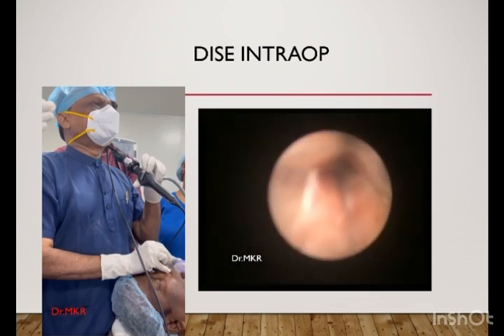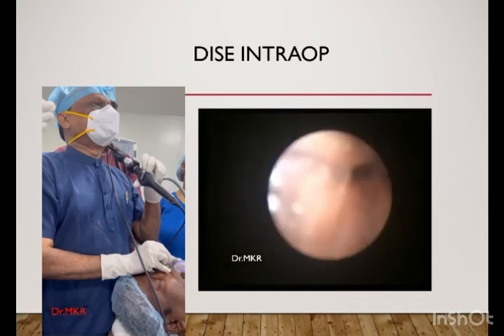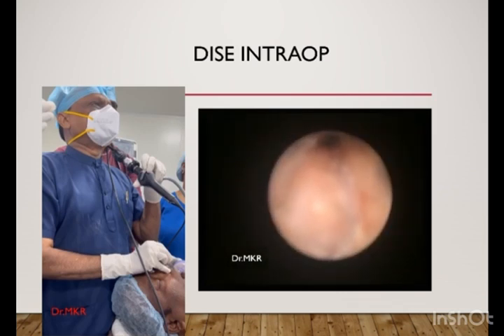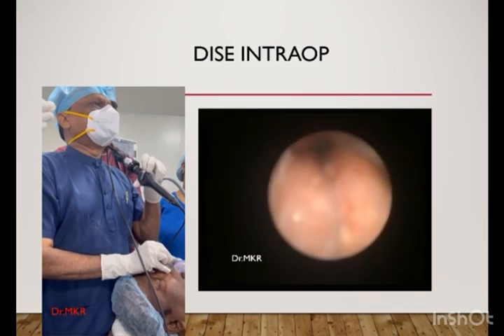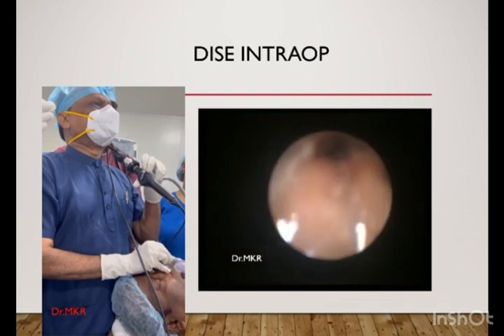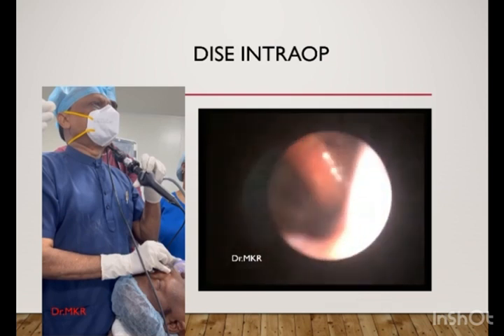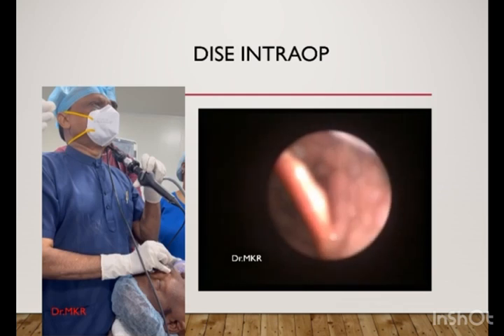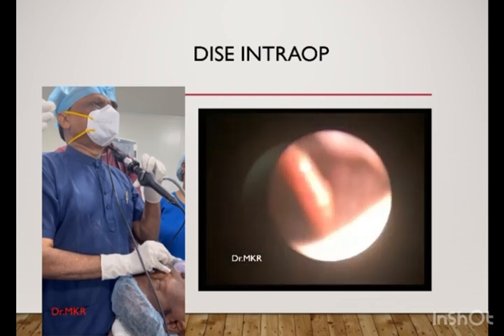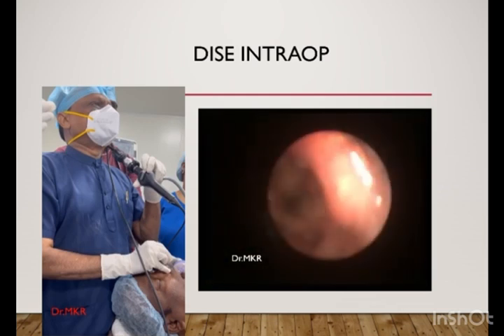Through the nasopharyngoscope, we can see the velum and the area just above the oropharynx. You can see the lumen — the posterior tongue is bulky, and the uvula is fluttering over the posterior pharyngeal wall.